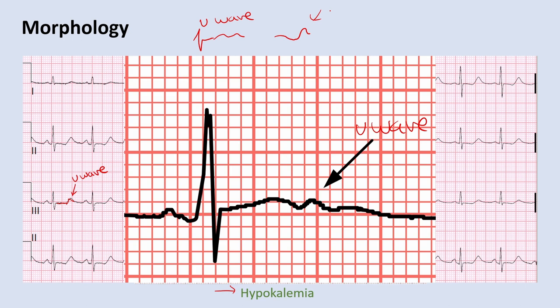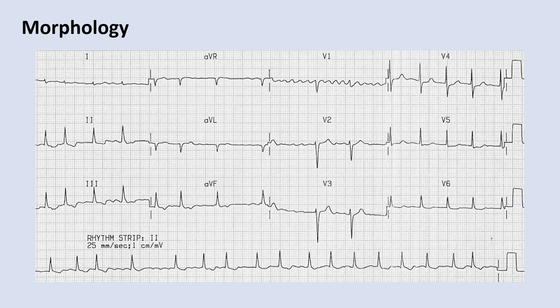This patient has an irregularly irregular rhythm with no clear P wave in lead 2, and in V1 you can see a fibrillating baseline. This is atrial fibrillation. Counting the QRS complexes — 17 complexes — times 6 gives a heart rate of 102. This qualifies as atrial fibrillation with rapid ventricular response, or AFib with RVR, because the heart rate is above 100.